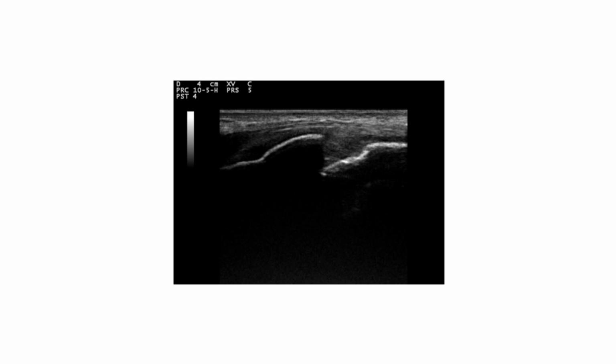This image can be observed at a slightly distant place from the previous image. The hypoechoic region between the bones is considered to be cartilage.